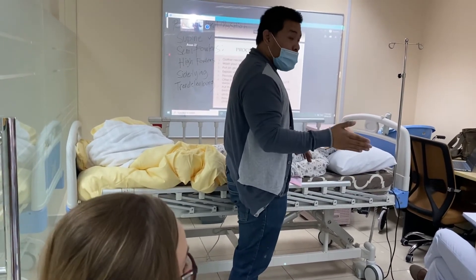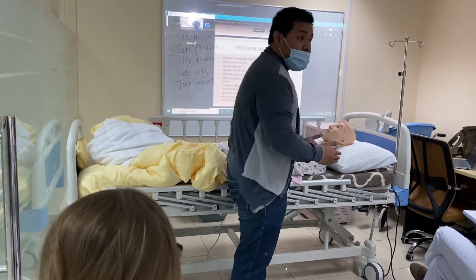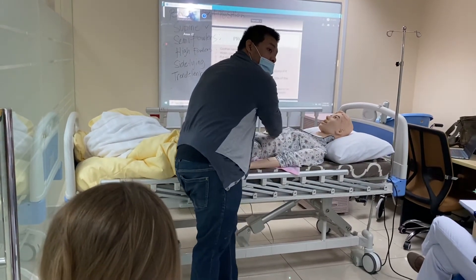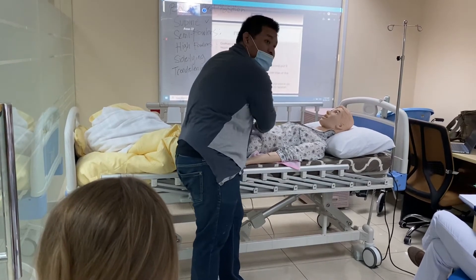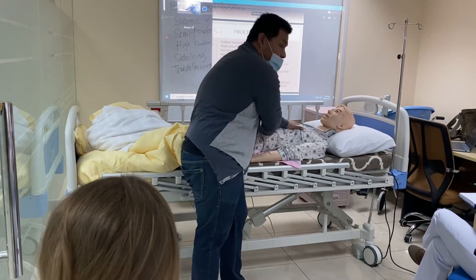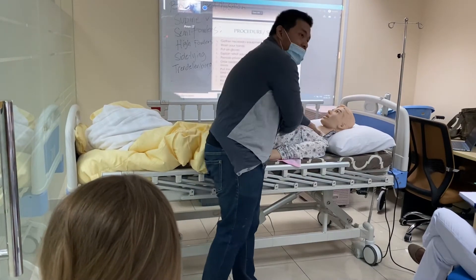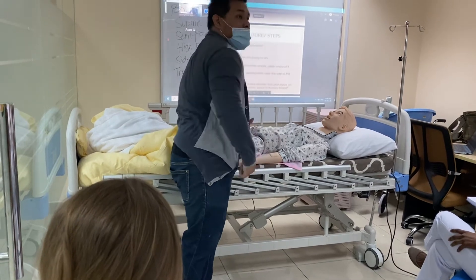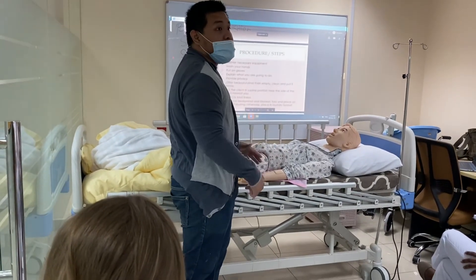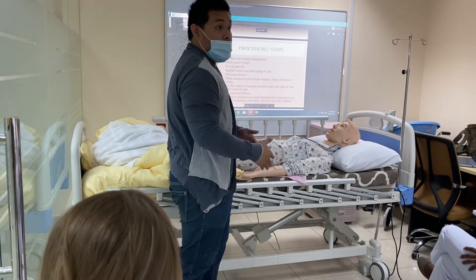When you try to pull them from the center to adjust, move this area first. When the client is bedridden, this will be the heaviest part — not the torso, not the head, not the legs, but here: the abdomen and lower back area. This will be the heaviest part of their body.